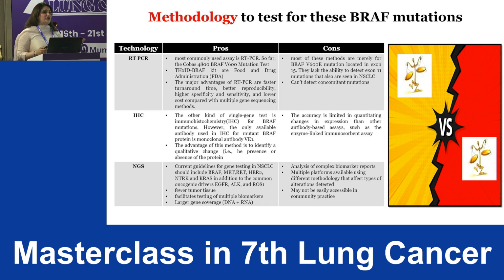I mean, it does have a good sensitivity, but in a lung setting, it's not just about knowing if your patient is BRAF positive. You need to know what type of mutation. Is it a fusion? Is it a deletion? All these make a difference with the type of treatment you're going to choose. And that's why NGS kind of trumps. And I'm not belittling these; these are standard of care, gold standards in their own right. But considering we have limited tissue, we need a host of information. We know there's so much crosstalk between different drivers that it becomes extremely important to get the entire picture. And this is why NGS is important.